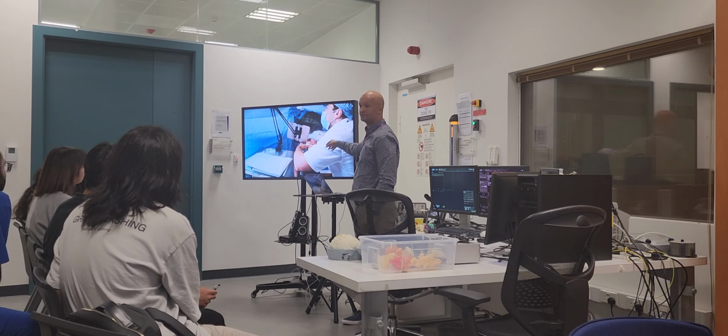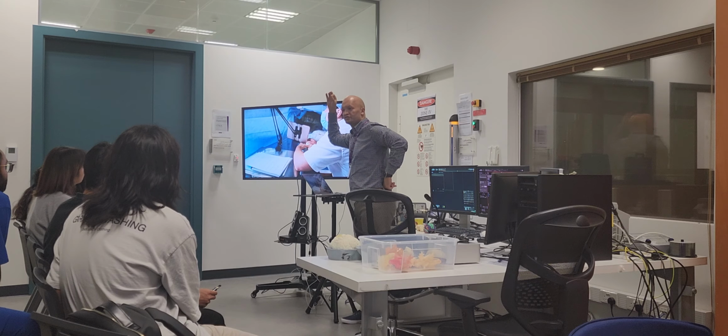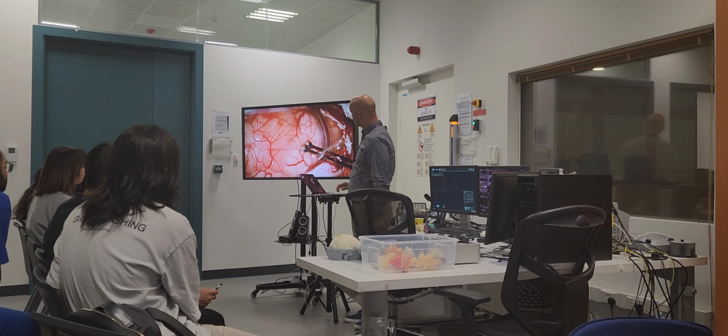This is during the surgery. Patient is awake, you can look at the fiber surface. She's awake, talking, motor function, sensory function, removing the tumor, and of course the complex assessment of language and speech generation during surgery.